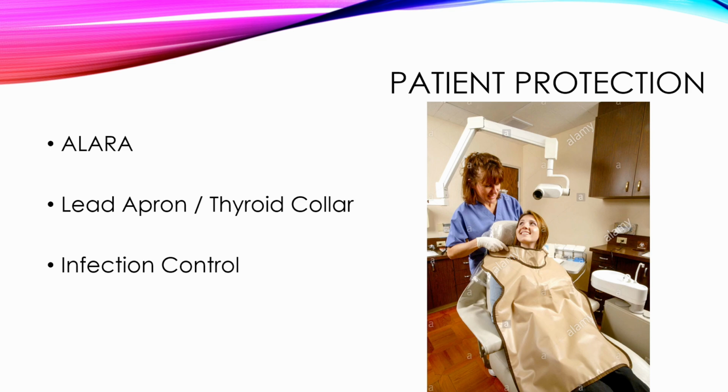This means disinfecting the lead apron, putting barriers on the exposure button and on the tube head and sensor, and wearing our personal protective equipment.